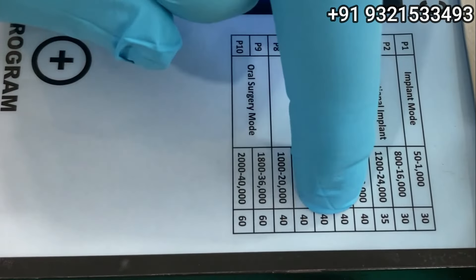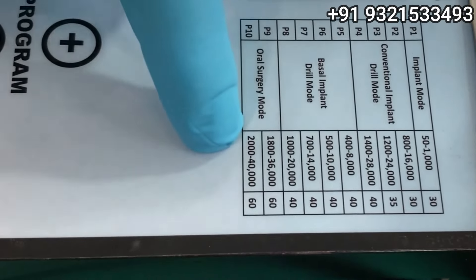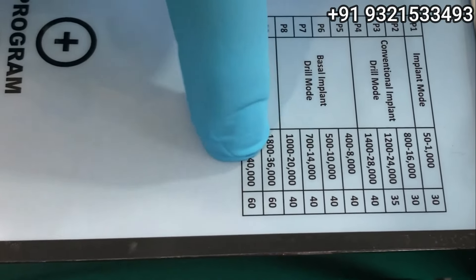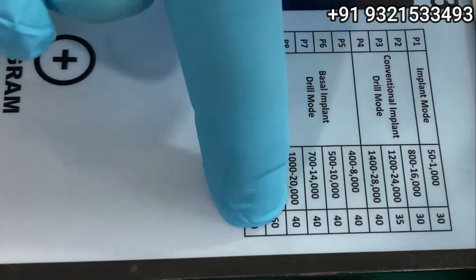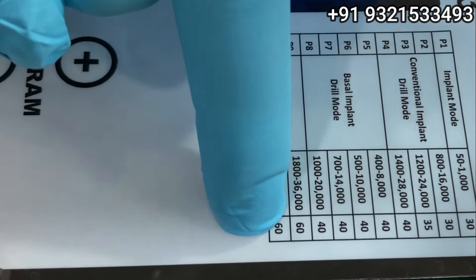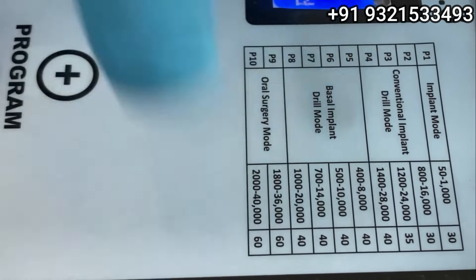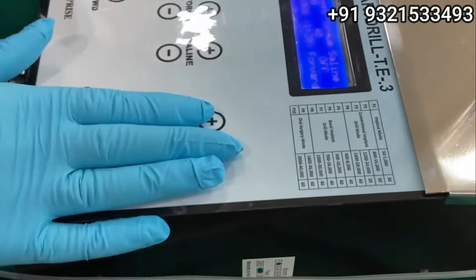The top setting is 40 Ncm torque, which I recommend. For people doing oral surgeries, you can use it at 36,000 and 40,000 RPM — the top speed — for your flap osteotomy, impactions, or any other surgical work on bone.